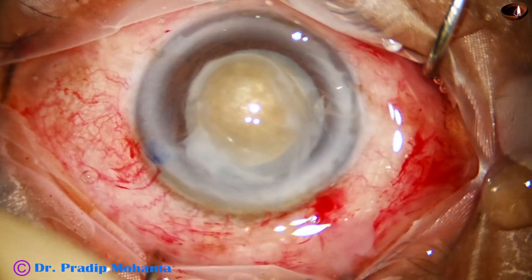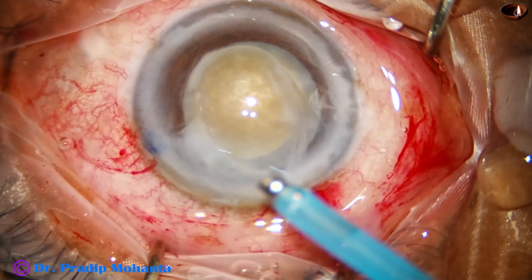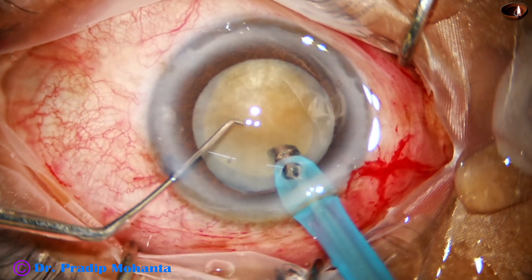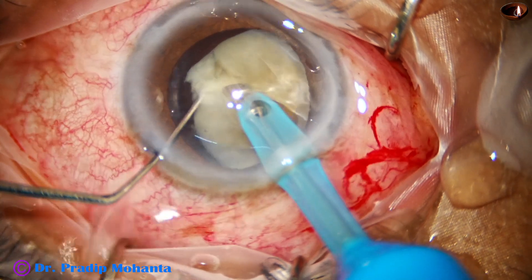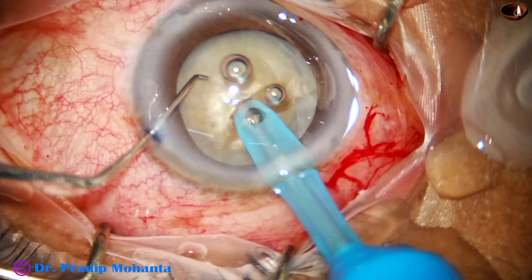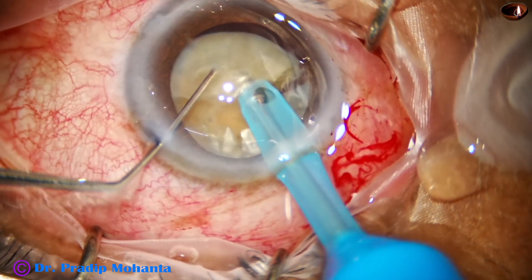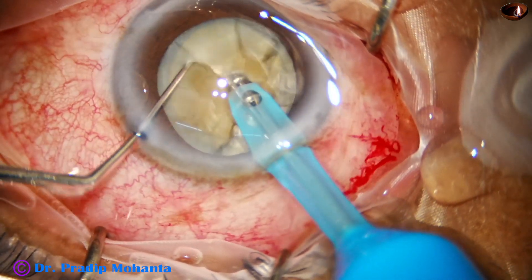More viscoelastic is injected and the phaco handpiece is taken. Ultrasonic energy is set to 80% in continuous mode, flow rate 40, vacuum 400. A combo chop technique will be used — with components of both vertical chop and horizontal chop to achieve nice cracks.